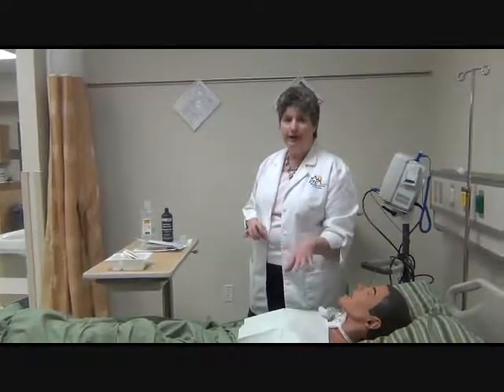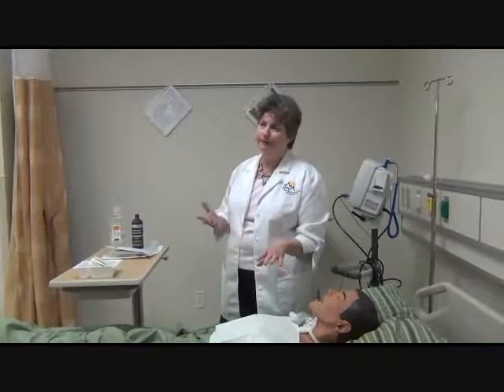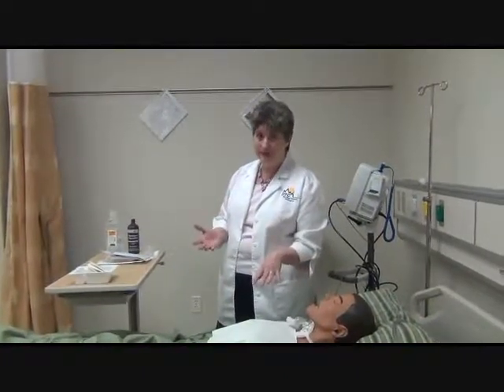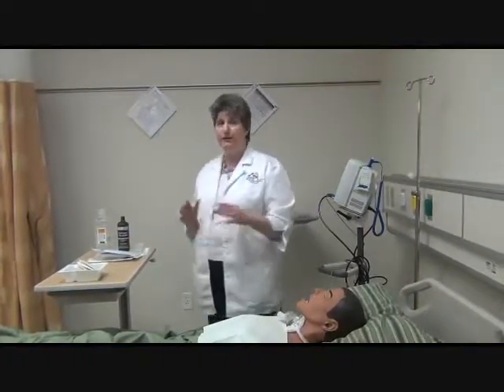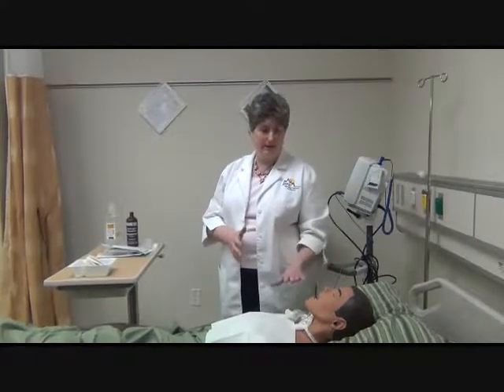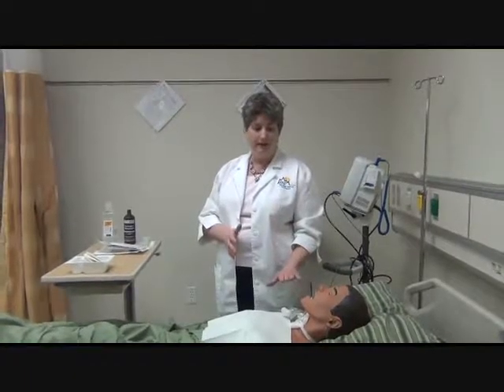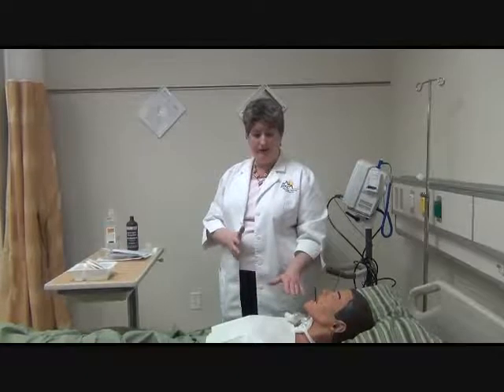Most trach care is considered more of a clean procedure than a sterile procedure. I learned sterile procedure, and it's just as easy to be sterile about stuff. The idea of this procedure is not to bring new bacteria to your patient. They're already going to be compromised with their airway because they're not using their nose or mouth as a filtering system, and so they're directly taking air into the lower airway when they have a trach.